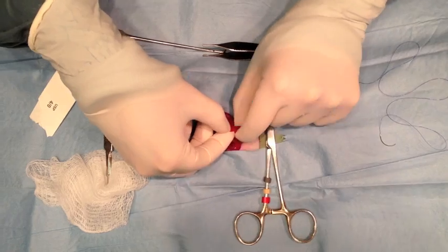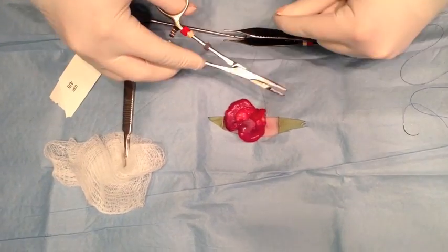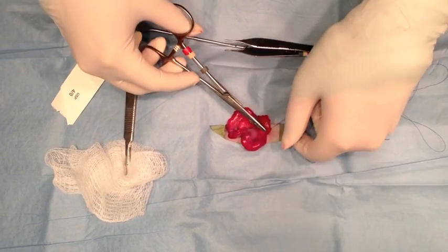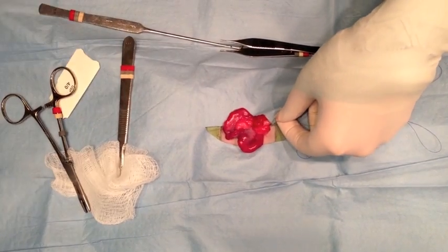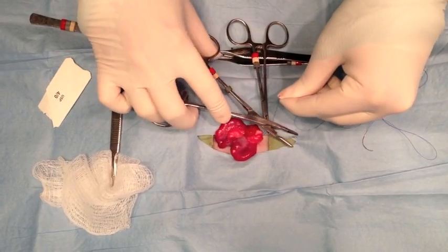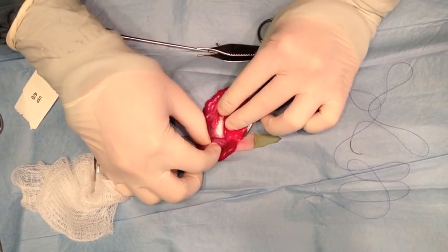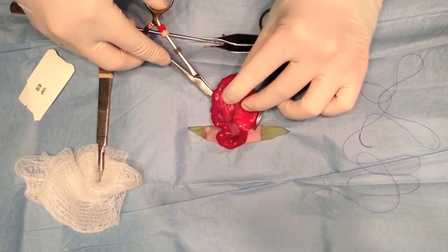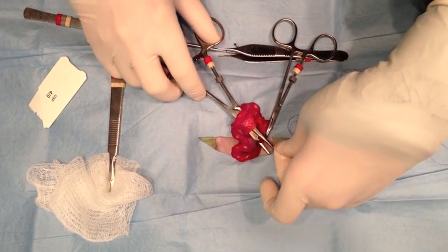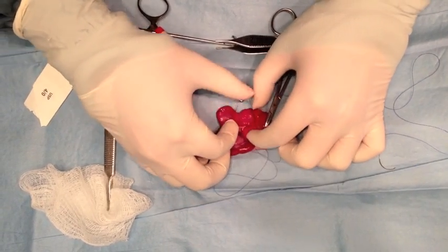Some people will clamp and that's totally fine, but for me I just don't want to rip anything, so I don't clamp. Here I am trying to tie a ligature and hold the ovary out far enough to get my ligature underneath the ovary so that I can trim it off and pull it away. I have made one ligature — you really don't need to make too many. I'm clamping the suture itself to hold everything out, and now I'm going to look for vessels within the broad ligament, which you would not need to worry about in a cat or dog. Here you have these vessels that go through the broad ligament and you need to ligate them.